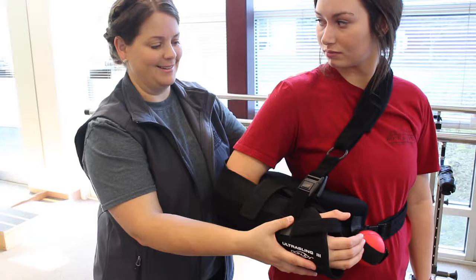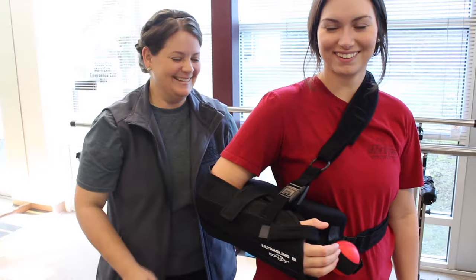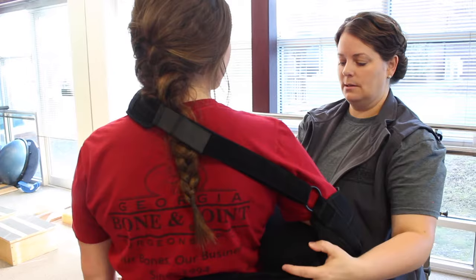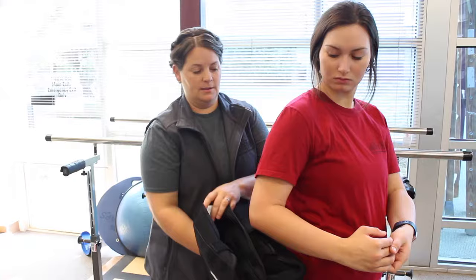Just looking at these slings can be a little intimidating and may even leave you thinking, how exactly do I even put this on? So to eliminate any fear or intimidation you may have, we created a step-by-step video to show you exactly how to wear your sling.